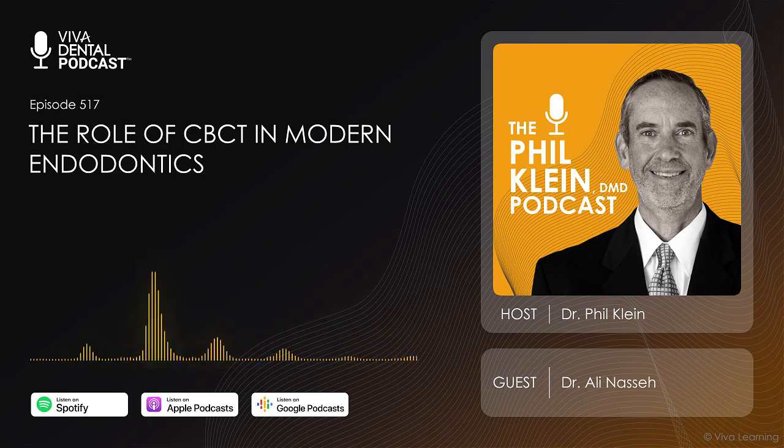But in terms of day-to-day operation on a regular case, it will help you be far more efficient, just like implant therapy. If you had to reflect the flap and then sound the bone to find out where the bone is before you could decide which direction to put the implant, that would take a lot of time. But if you know exactly ahead of time where the danger areas are and which direction the implant should go, that will save you a tremendous amount of time.